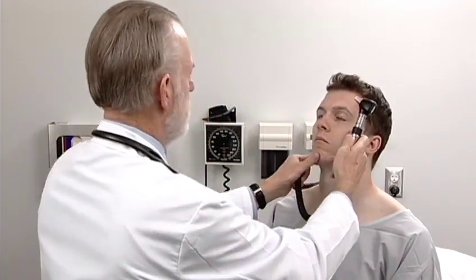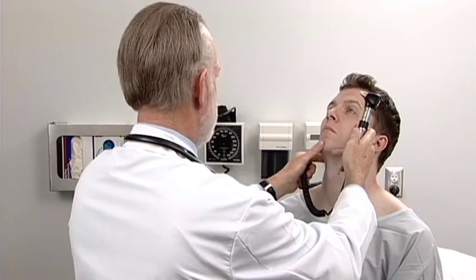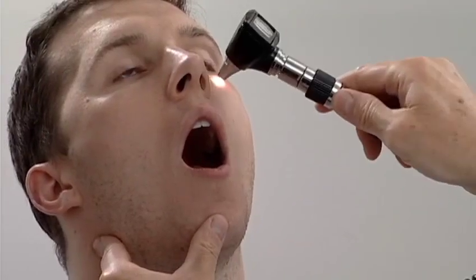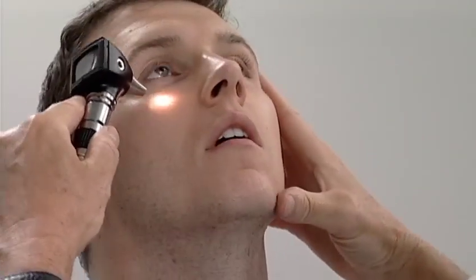To transilluminate the maxillary sinuses, you have the patient extend his head, open the mouth, and we're going to place the light against the maxilla in this position, and we're going to look for light appearing on the hard palate inside of the mouth. If there's good transmission, that will appear pink and light. Same thing on the other side. Open your mouth and we'll look in there. Okay. And transillumination of these sinuses will look like this.